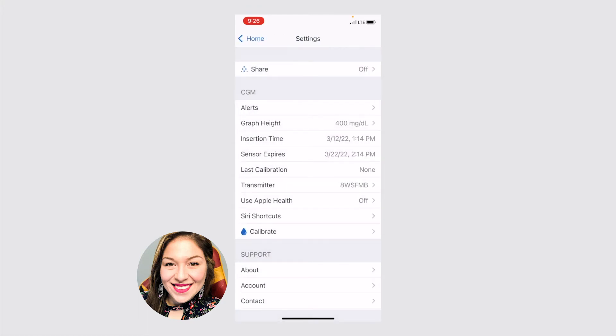Going back to our settings, there's also some really great information here, your insertion time and your sensor expires time. So this shows you what time your sensor started. And again, these sensors last 10 days. So I started mine on the 12th. So it'll end on the 22nd.